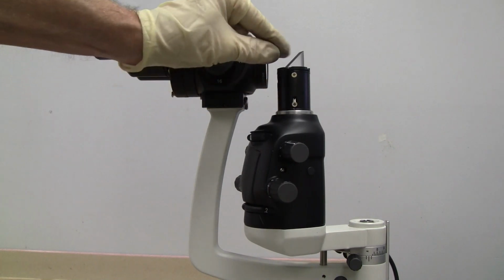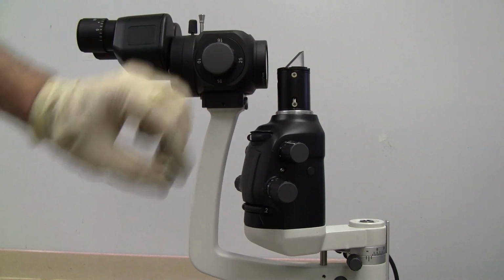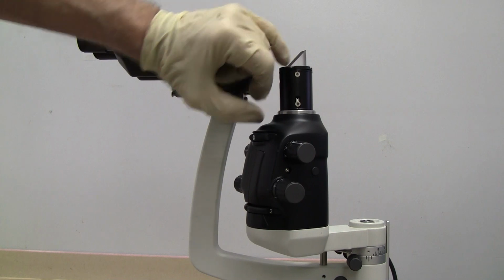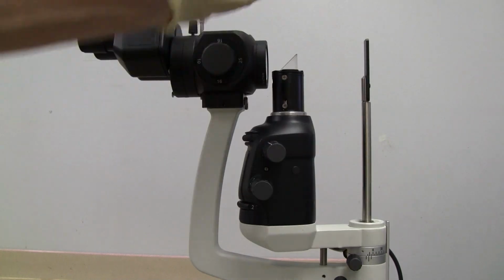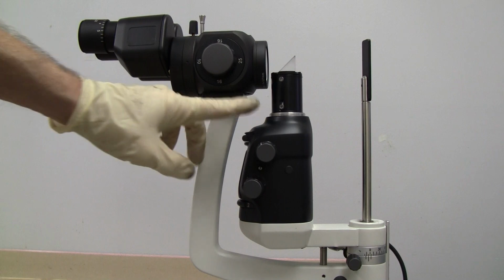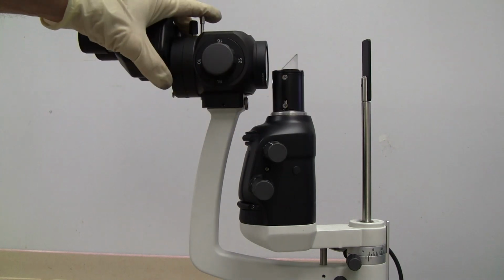And underneath, on top of here, you can adjust your prism to go one way or the other, up or down, by some Allen screws up here. When you have your focus rod in place as you're looking through your view, you can move this prism a lot of different ways to get it centered.